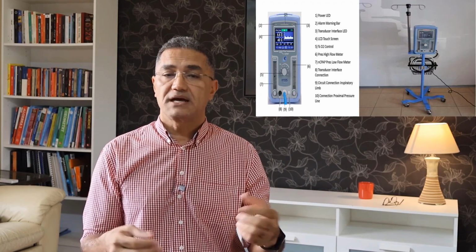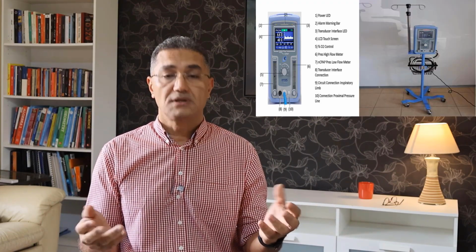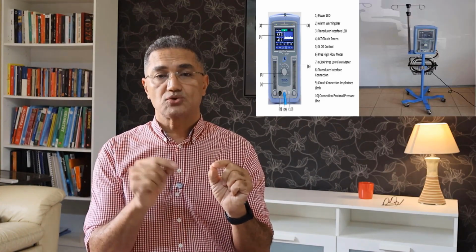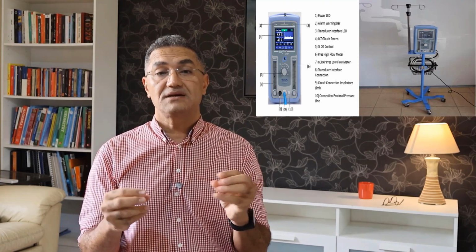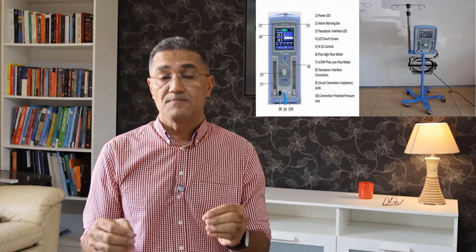So can I use either a CPAP or a BiPAP or even a ventilator for any patient? Of course, there is a difference. The difference is, first, let's just understand a little bit about each machine. The CPAP machine is a device that we use only in the unit, and it is a machine. In fact, it's very unique because ever since it was created, it has looked exactly like what you see now.